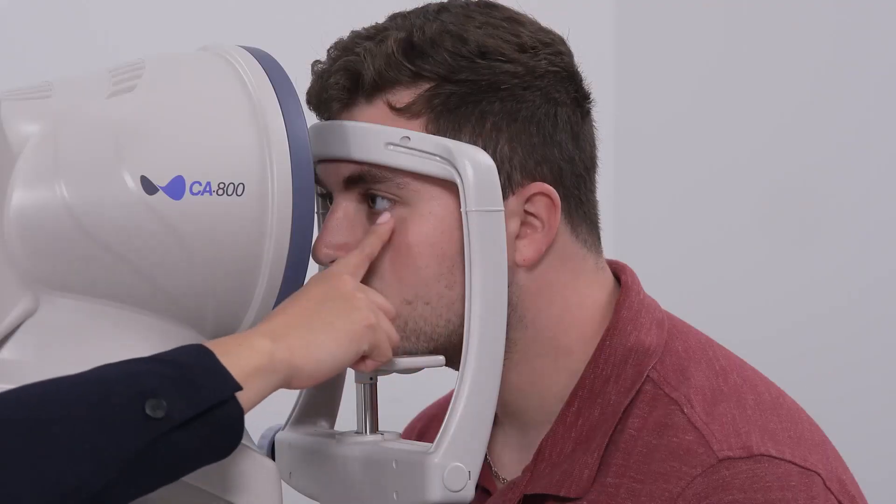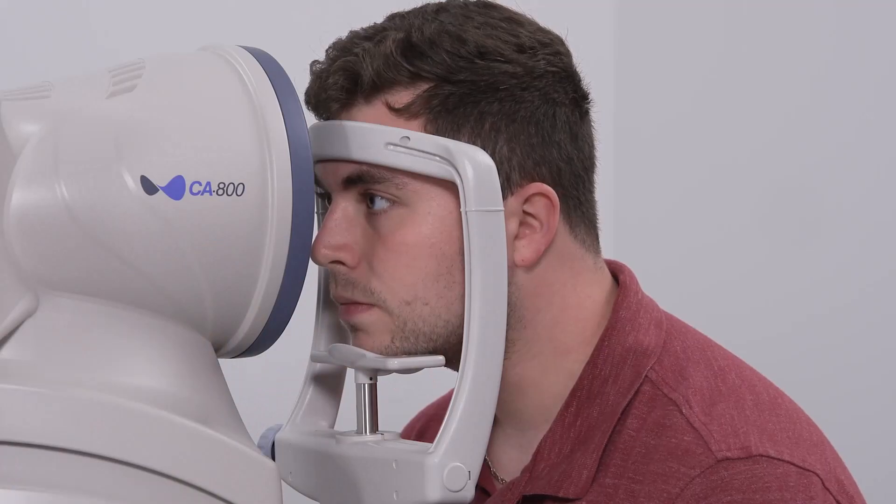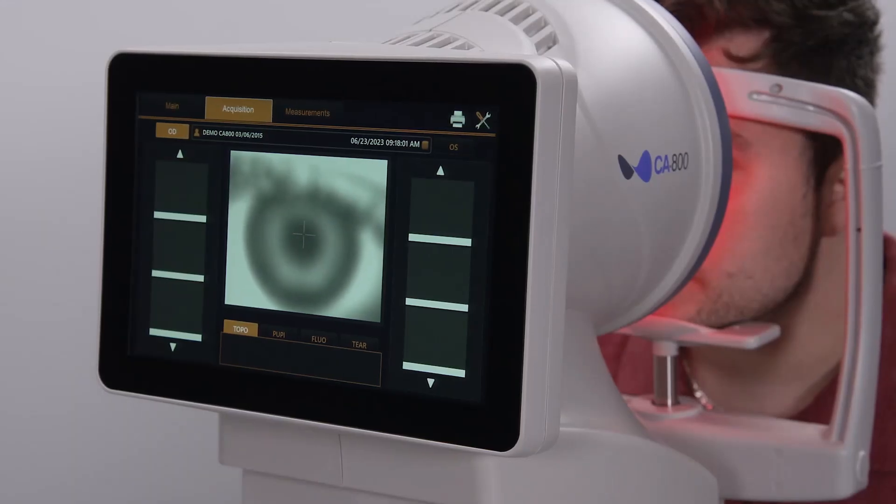Adjust the chin rest height so the eye is aligned with the canthus marker. Adjust the table height as necessary for the patient's back and neck comfort.